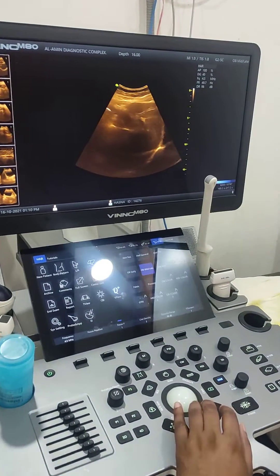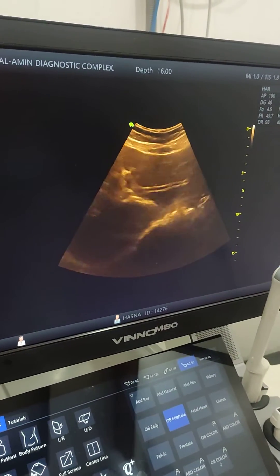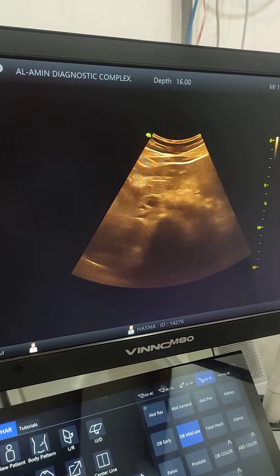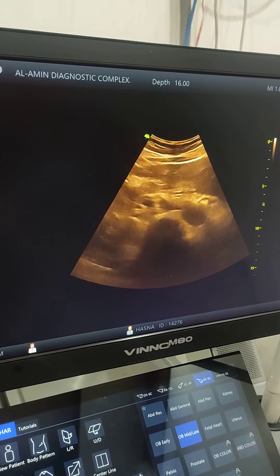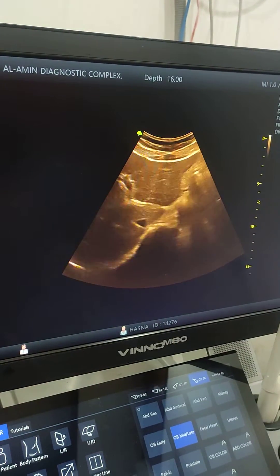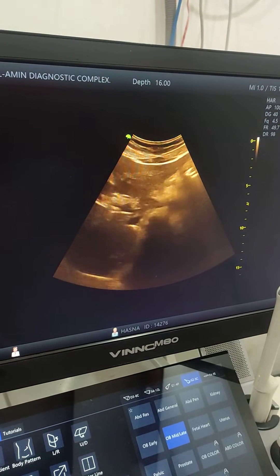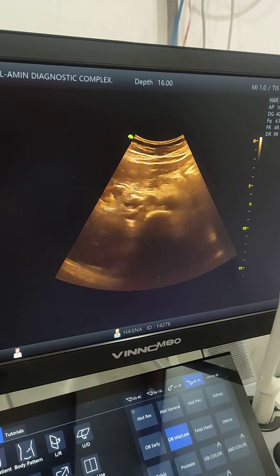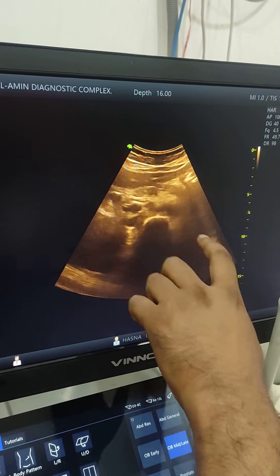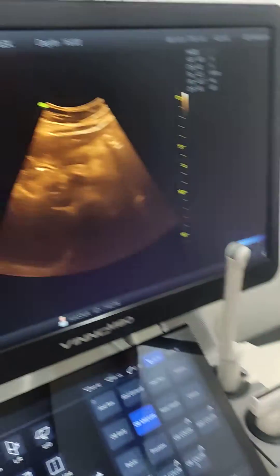A 50-year-old female patient came with severe upper abdominal pain for ultrasonography. This is the right lobe of the liver, this is the left lobe, this is the pancreas, and this area is where the severe pain is located.